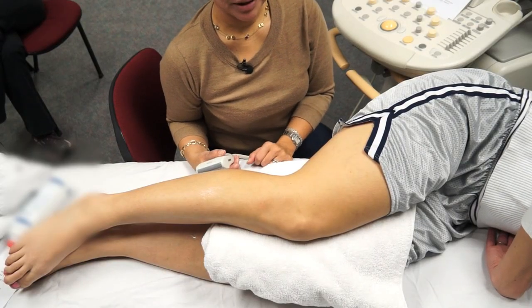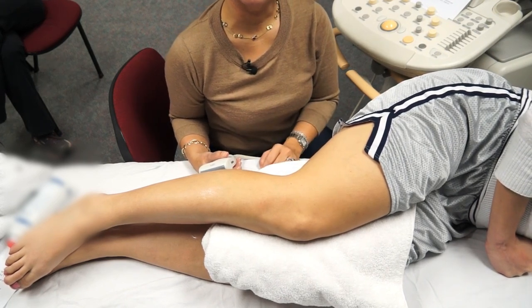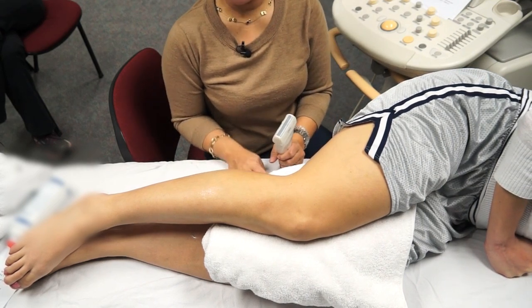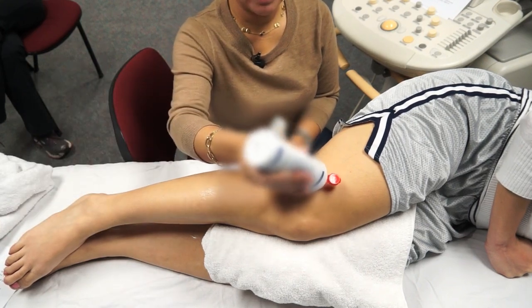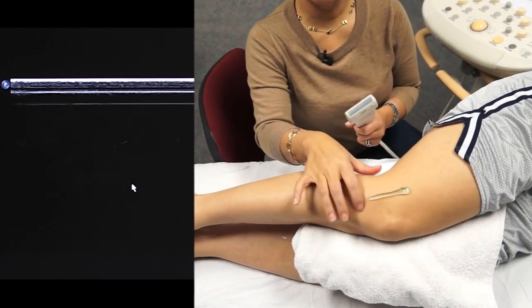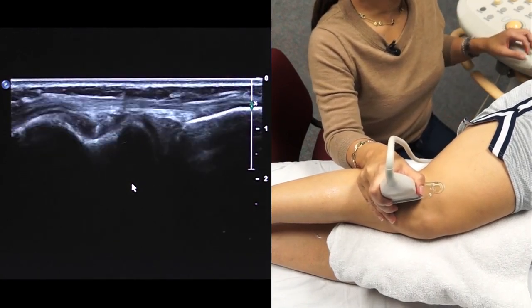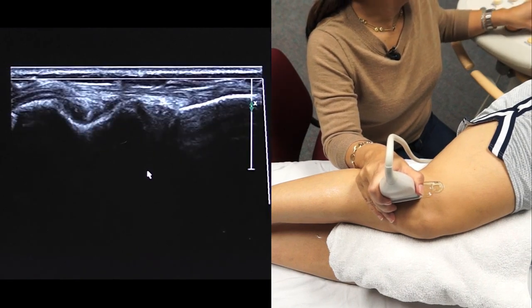Now moving on to the lateral knee, we have your patient lie in the decubitus position with the part that you are scanning up. You can also make them more comfortable by either putting a pillow or a rolled up towel between their knees, okay, and have their legs partly flexed. I'm going to start with the iliotibial band. So you can palpate for Gerdy's tubercle where the iliotibial band inserts and place your transducer just cranial or superior to that structure. Let me just adjust my depth here.